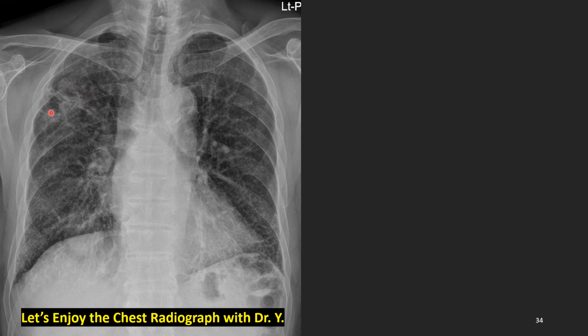This seems to be mass or pneumonia. Yes. And how about right lower part trachea area? Distal trachea is not good looking. Okay, this is another mass too. So mass, mass, mass, and mass with the background usual interstitial pneumonia. Very, very serious.